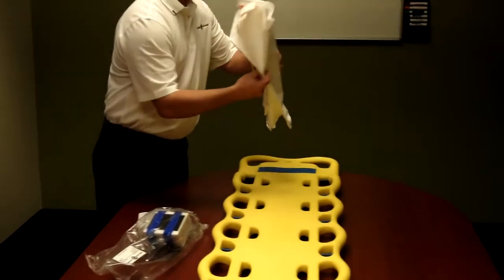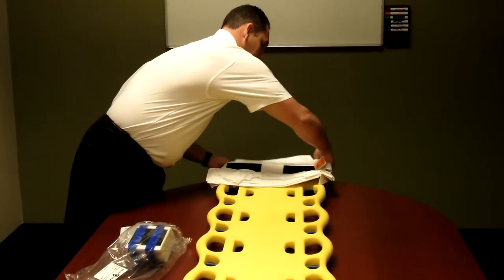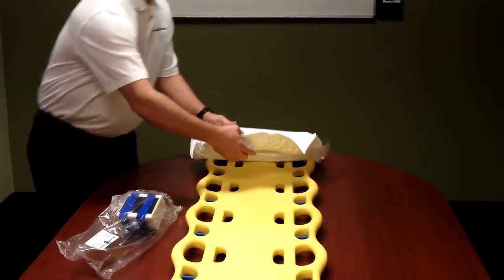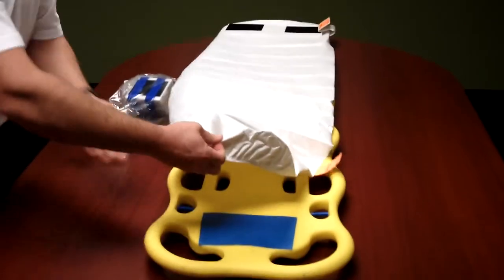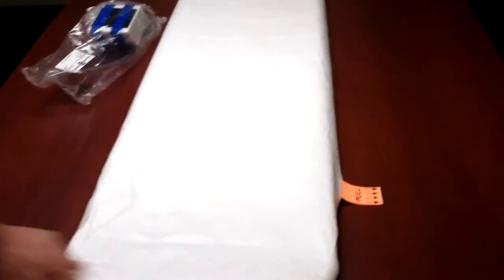You want to take the top of the head base and take the cuffed end and wrap it over the head portion of the backboard. Then you want to take the bottom and wrap the elastic around the base of your backboard.